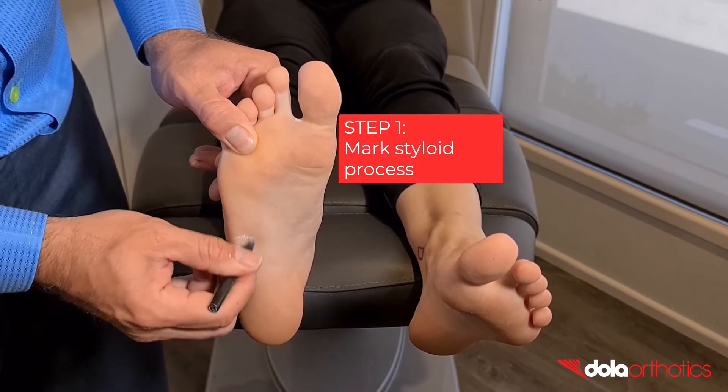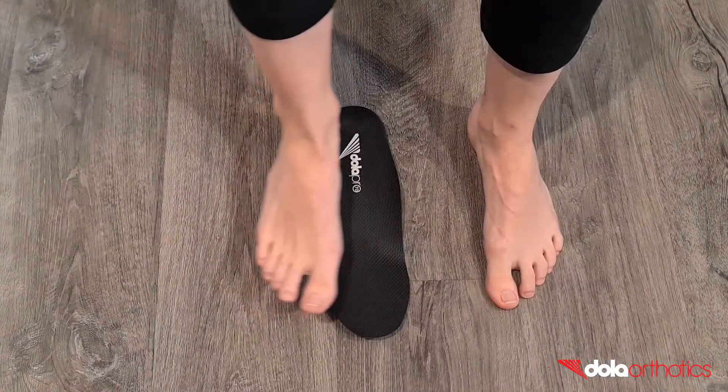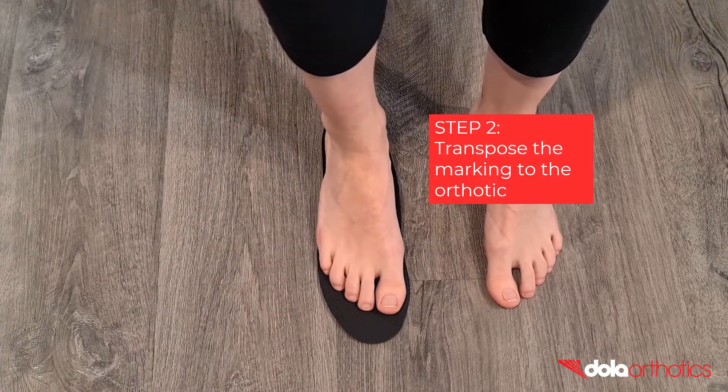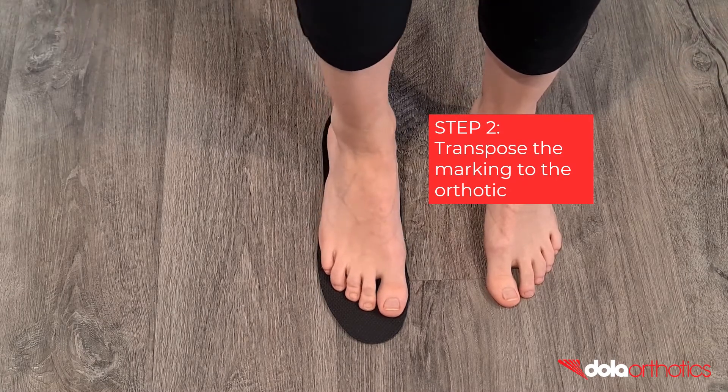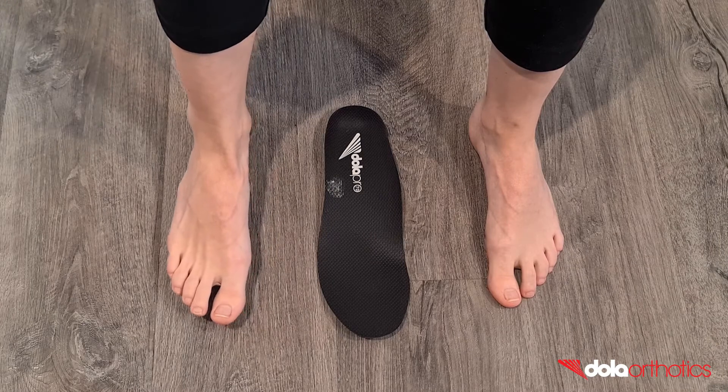Step 1: Use a pen or lipstick to identify and mark the styloid process on the foot. Step 2: Stand on the orthotic to transpose the weight-bearing position of the styloid process. You now have your area marked as a guideline for grinding.